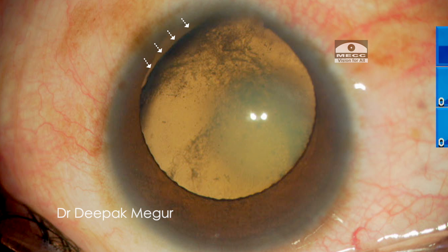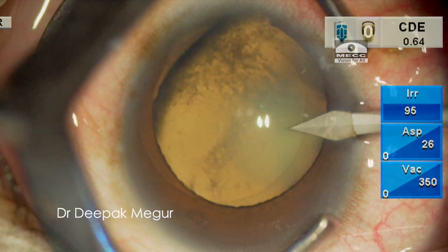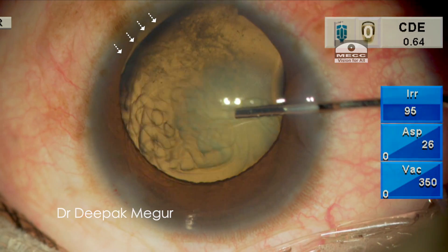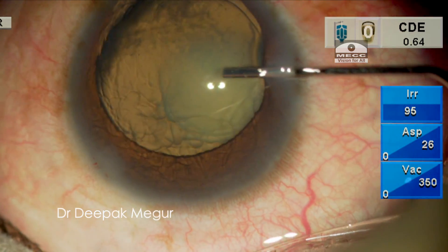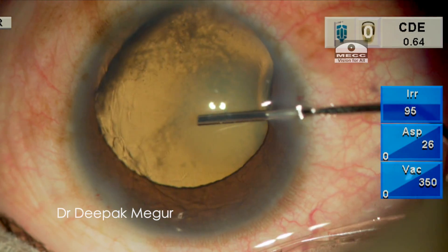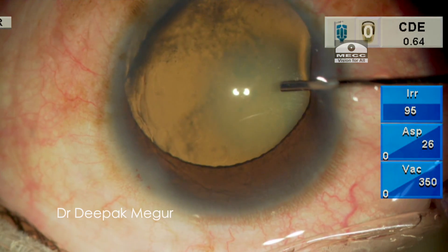I begin the surgery. The side ports are created. Dispersive OVD is injected to tamponade the area of zonular defect, and I'm avoiding the use of trypan blue since it might enter the vitreous cavity through the area of zonular defect and hinder visualization during surgery.